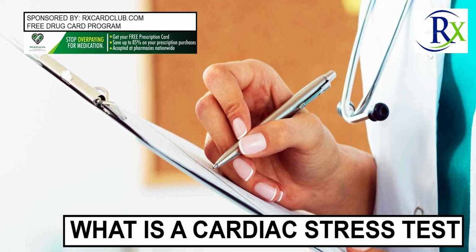Periodic stress tests can also be used to monitor the progression of congestive heart failure, where the heart is not pumping blood as it should, or assess how well you are recovering from a heart attack.